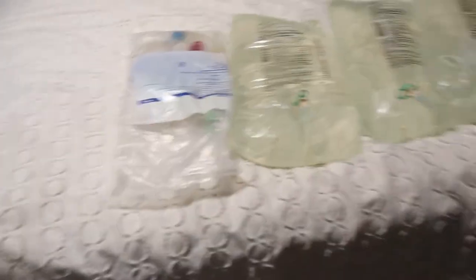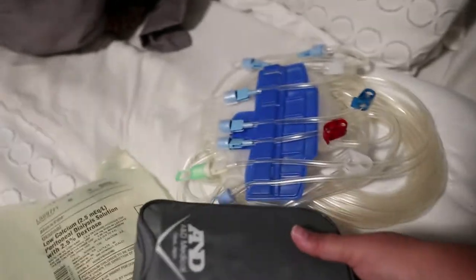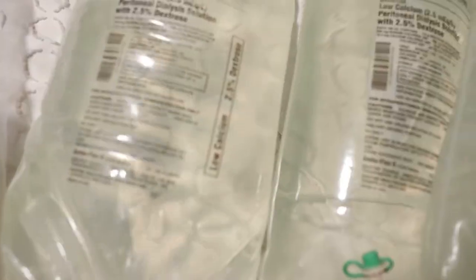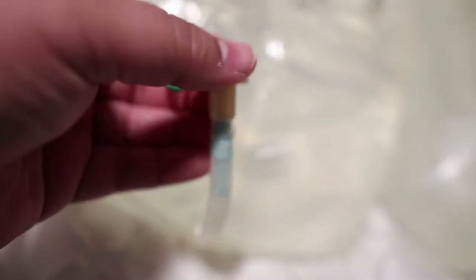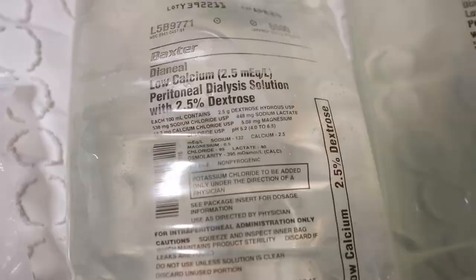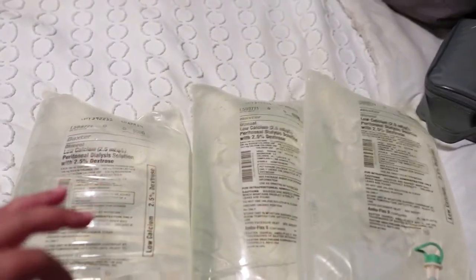The next thing are the supplies. This is called the cassette — it comes packaged like this with all the tubing. The brand we use is Baxter, and that's important because there are different brands. These green tabs let you know the strength of the solution: yellow is less strength, green is medium, and red is the strongest. The stronger the solution, the more fluid it pulls out of him. It is 6,000 mL, so there are six liters per bag.